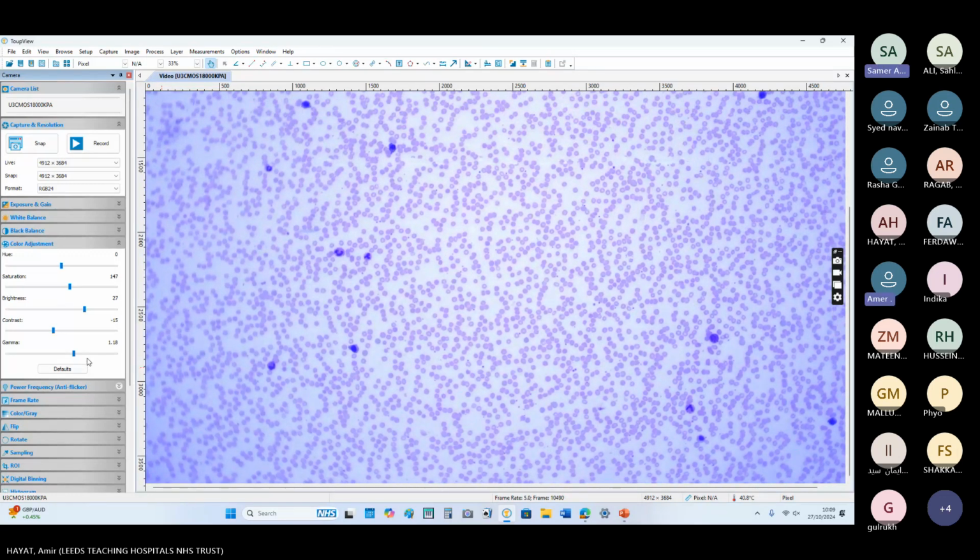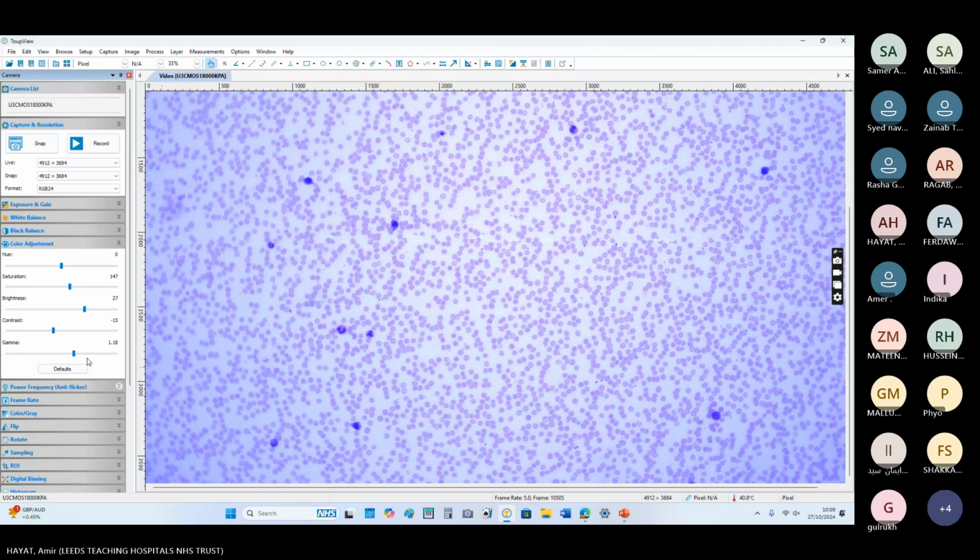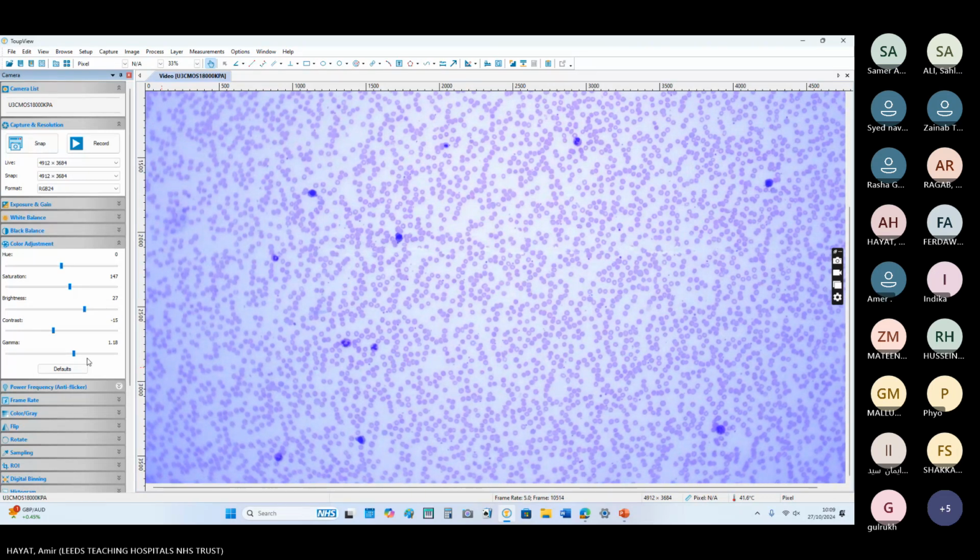Same patient as the CLL? No. This is a new patient who is a 70-year-old patient with the previous diagnosis of multiple myeloma on VCD chemotherapy, presented to you with worsening back pain.